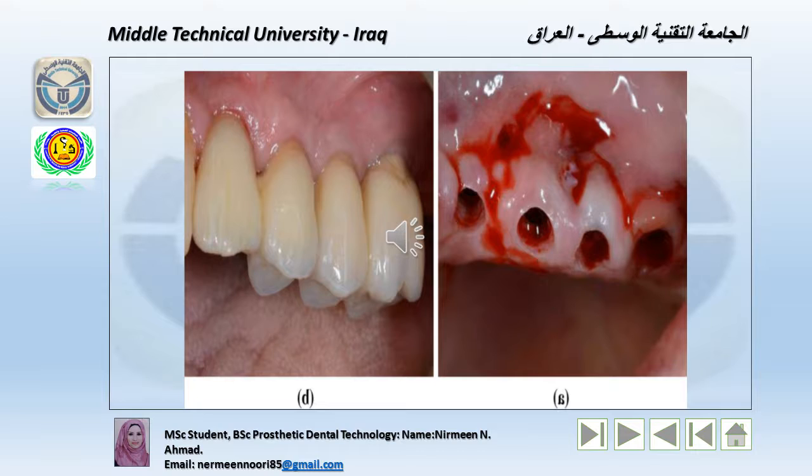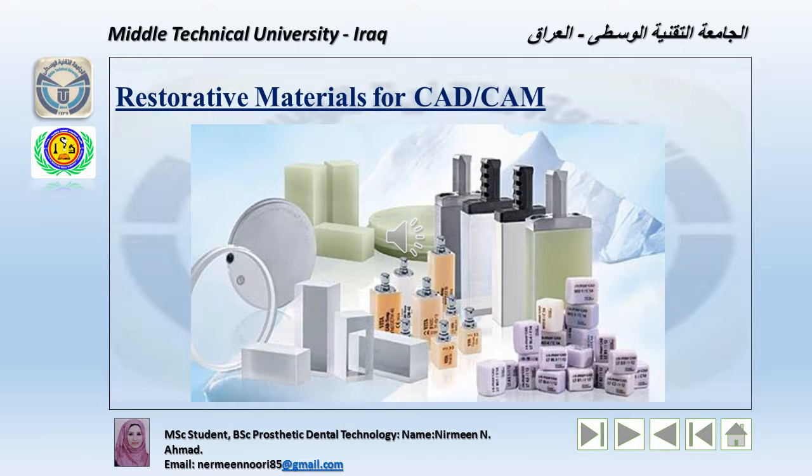After the surgical guide was designed, the implants were inserted using a totally guided flapless surgery approach. Immediately after surgery, the temporary restoration was screwed on the fixtures. This picture shows some of the restorative materials used for CAD-CAM.